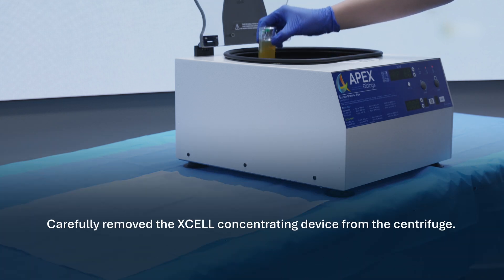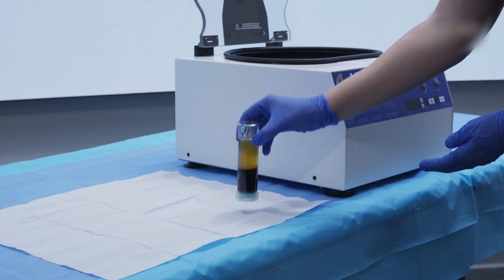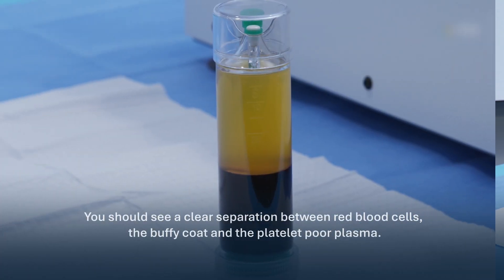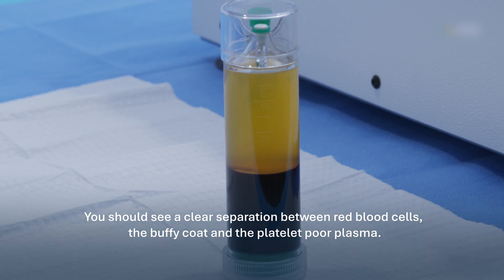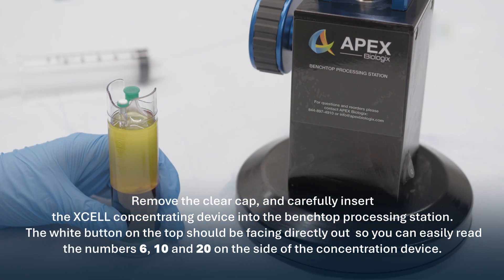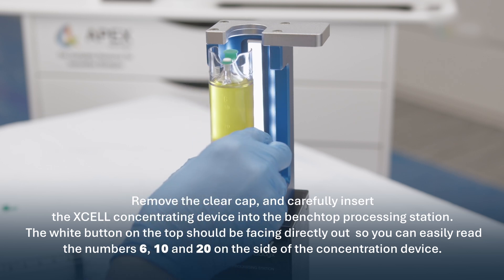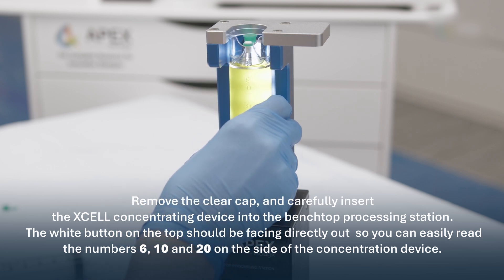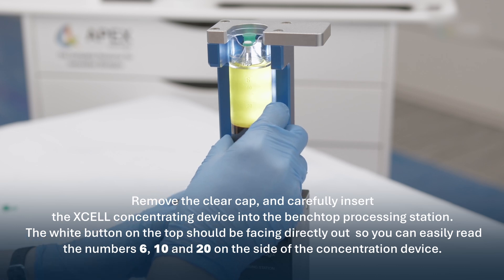Carefully remove the XL concentrating device from the centrifuge. You should see a clear separation between red blood cells, the Buffy coat, and the platelet-poor plasma. Remove the clear cap and carefully insert the XL concentrating device into the benchtop processing station. The white button on the top should be facing directly out so you can easily read the numbers 6, 10, and 20 on the side of the concentrating device.